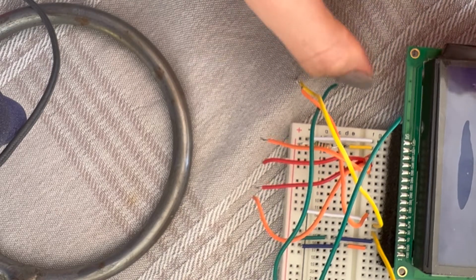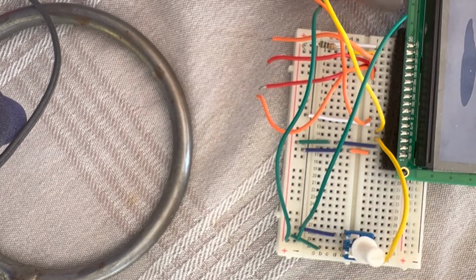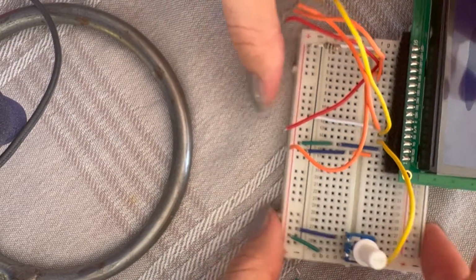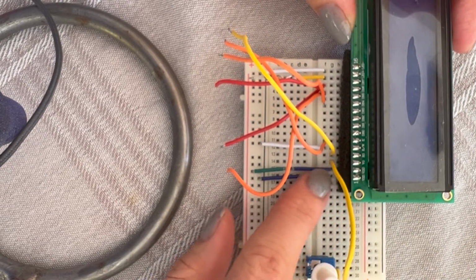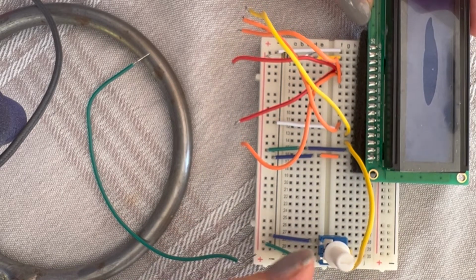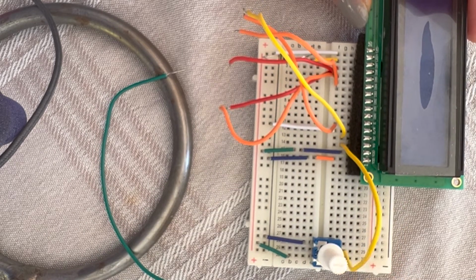And then we have a potentiometer, which, when we test it, you can see what it does with the LCD. So these two wires should go aside. The first pin of LCD is connected to the ground, and then we will connect the ground to the Arduino board. The second one is to the positive. The third one goes to the middle leg of the potentiometer.